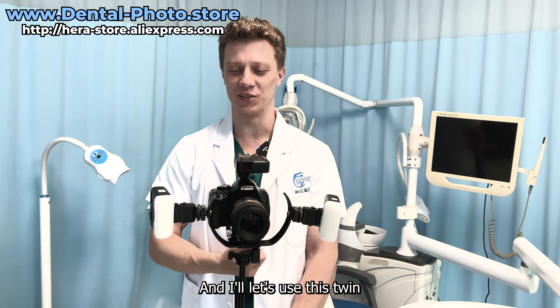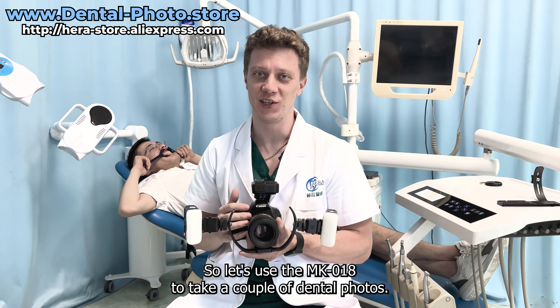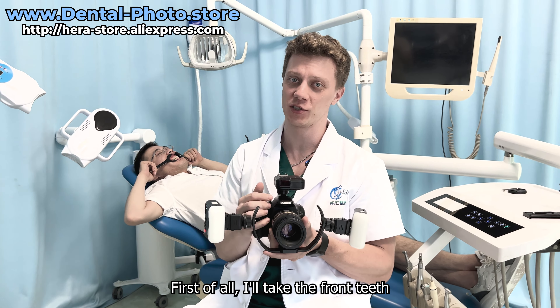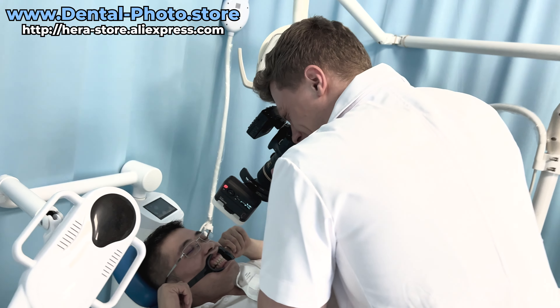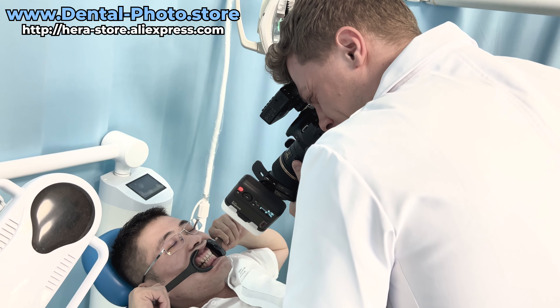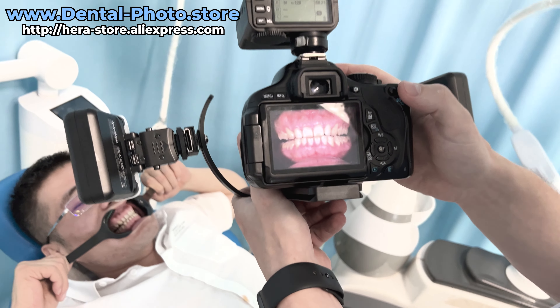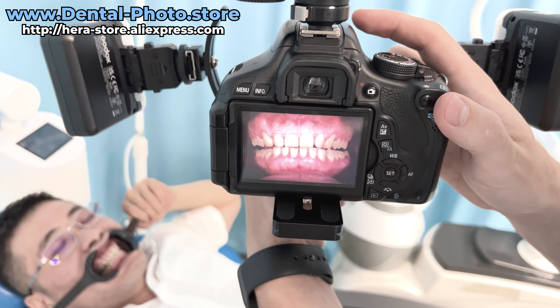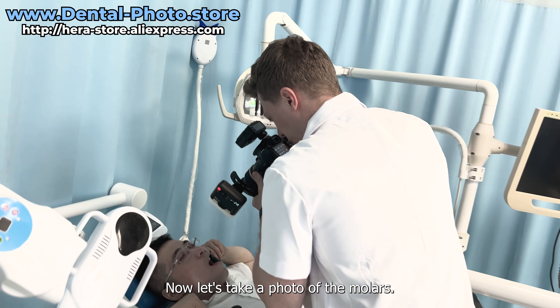Now let's use the MK-18 twin flash camera bracket to take a couple of dental photos. First, I'll take the front teeth. Now let's take a photo of the molars.